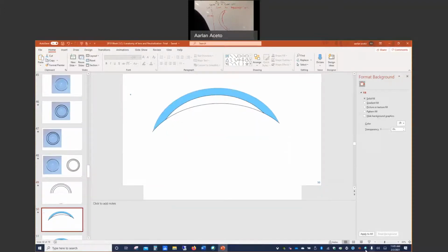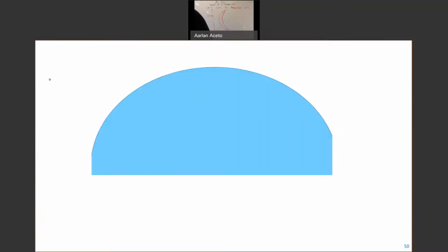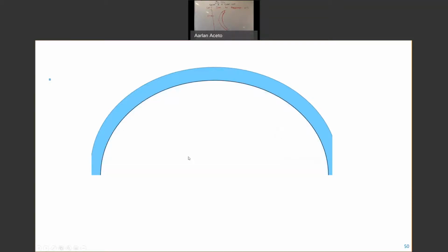Imagine if you had a chunk of plastic here, and we have these little buttons that we manufacture, really cool. And you have the front curve that we're going to be looking at. Well, we want to make the back curve. And so this is about what's going to match how steep the patient's cornea is. But we remember we want to get rid of these little edges off to the side. So we're going to get this off as well.